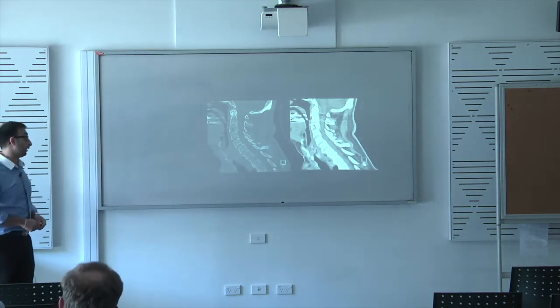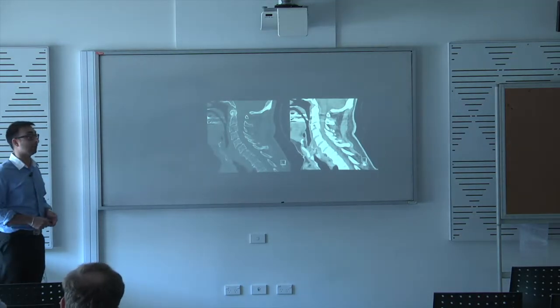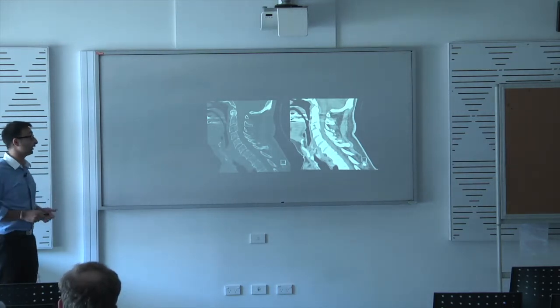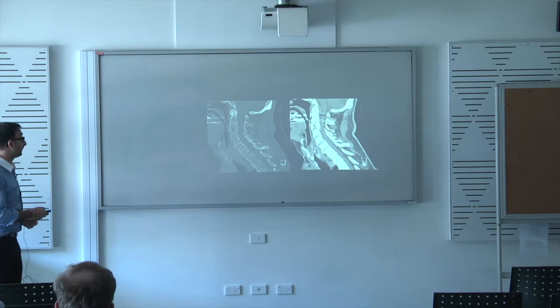In my limited experience, often the neurosurgical and orthopedic people will get an MR, particularly if they're thinking about fixating the spine. I'm just putting in the other CTs to show you that we're not lying, and also it's nice to look at different modalities. Any questions at all, feel free to ask at any time. I'll do my best to answer them.